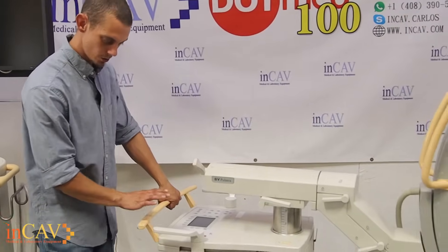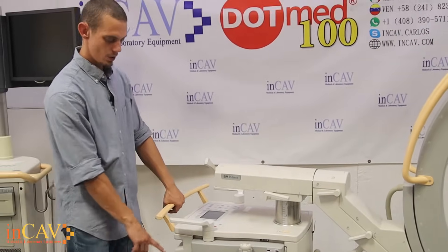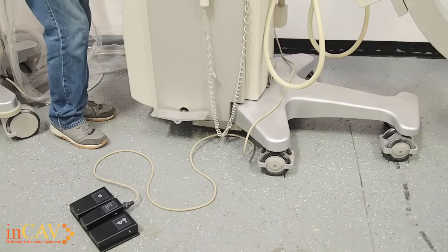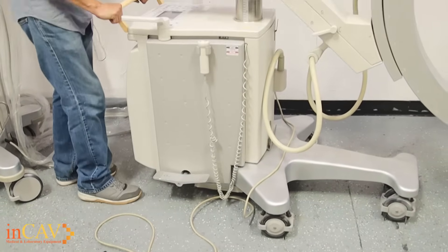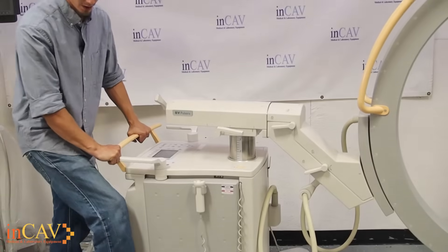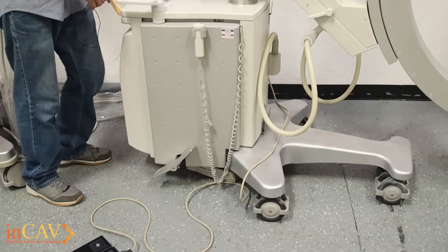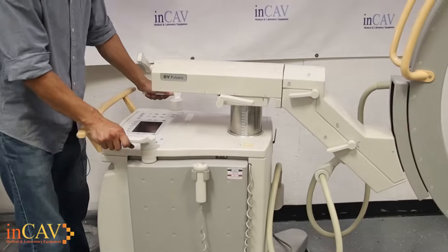To position the C-arm the way that you would like, first off you have your brake. Right now it is on. You simply push it forward to turn it off so that way you can actually move the unit itself. And once you have it where you want it, put the brake on.